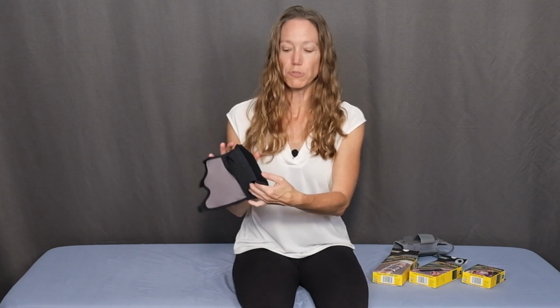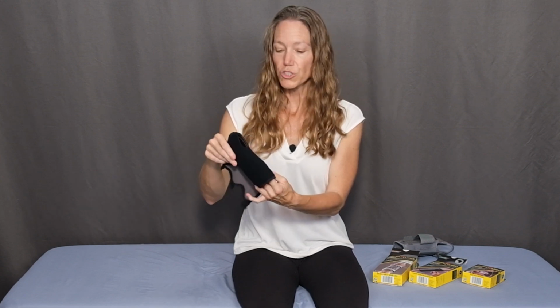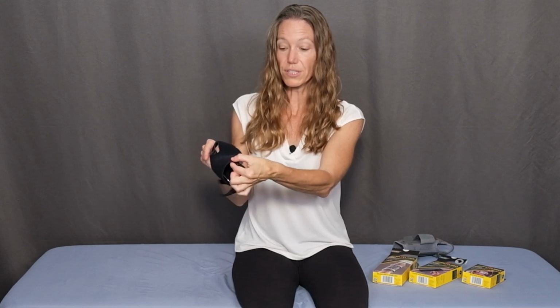Okay, so with the straps open, I see that there is a sleeve here, and there's the thumb hole. So this brace also has the metal stay. If I reach inside, I feel this opening, and I could pull this metal stay out and switch it over to the other side here. Right now, the stay is in a position to be fit for the right hand.